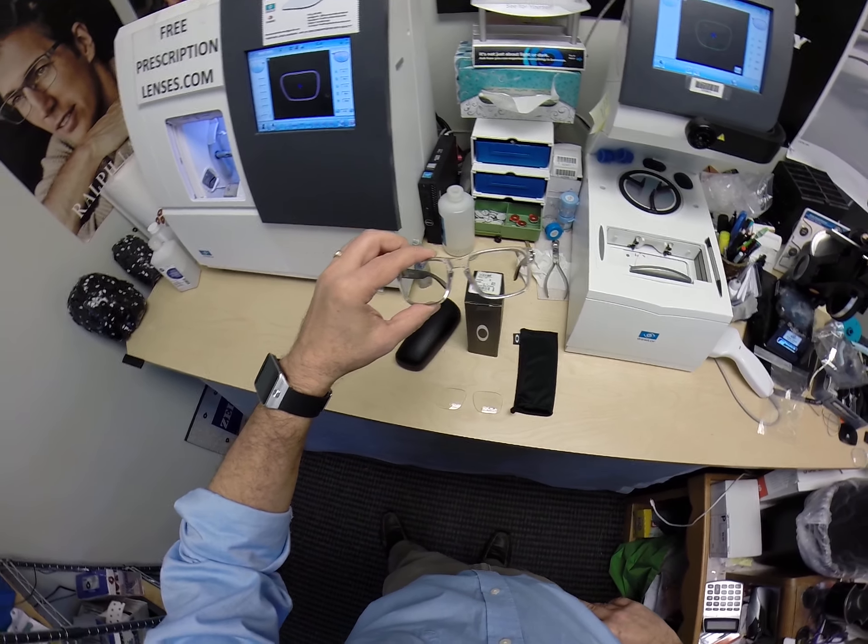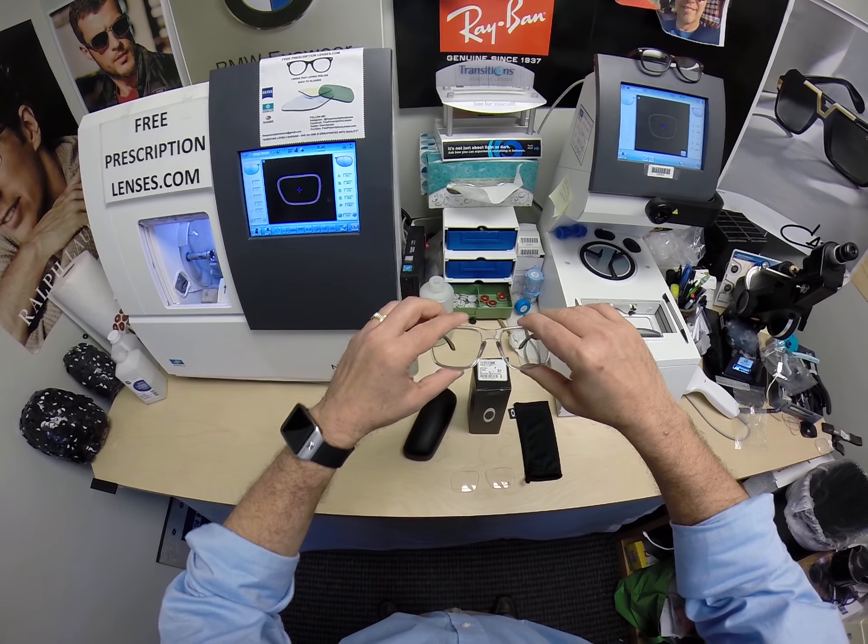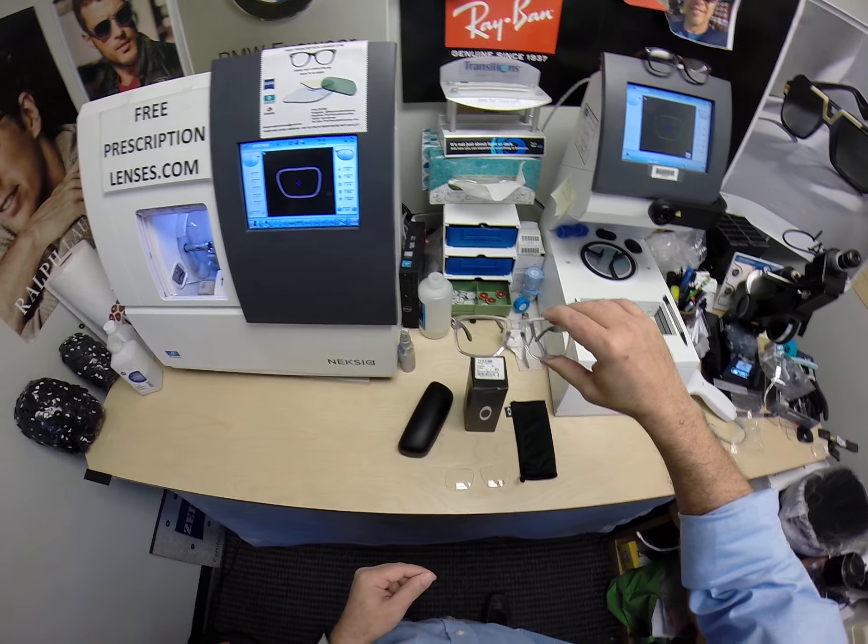Hello everyone, and a special big thank you to Greg in Brambleton, Virginia. Seymour Better here with FreePrescriptionLenses.com — but call me Mo, MoBetta — because I'm having you seeing MoBetta, looking MoBetta, and I show everyone else how I bring that love and feeling back to glasses.